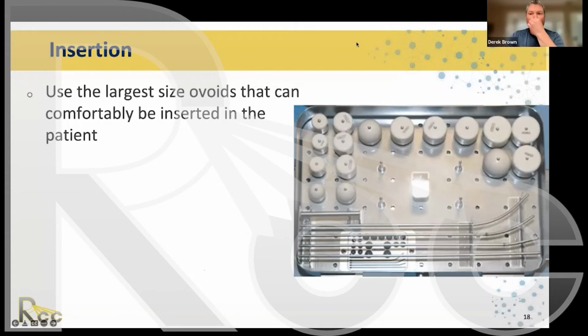With CR images, we would typically be acquiring orthogonal images, right? Planar orthogonal images. And that is totally fine. That's what, before we had the ability to do three-dimensional imaging, either with CT or MR, all of us were planning with two-dimensional images. So it's definitely possible. Until maybe 10 or 15 years ago, it would have been considered standard of care for us in the US. And as long as you're using point A, then that could be considered standard of care.